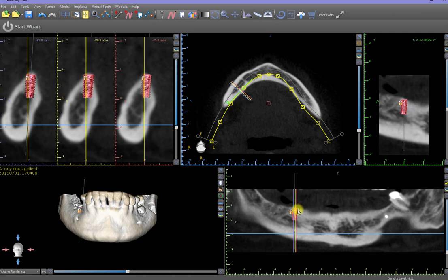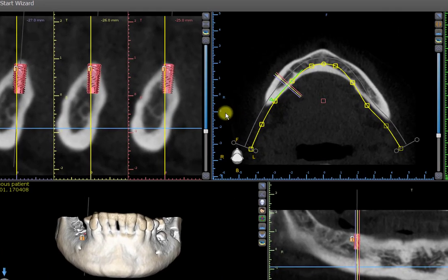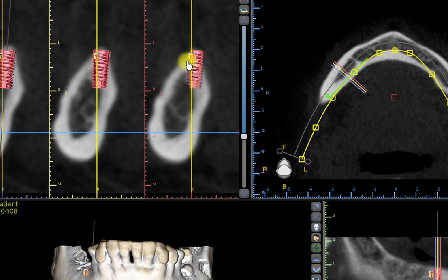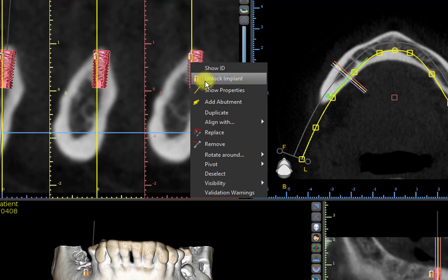If the issue was not being able to move implants, there are several solutions. The implant may be locked. Look at the implant to see if there is a lock icon on it. If so, right click on the implant and from the menu, left click on Unlock Implant.